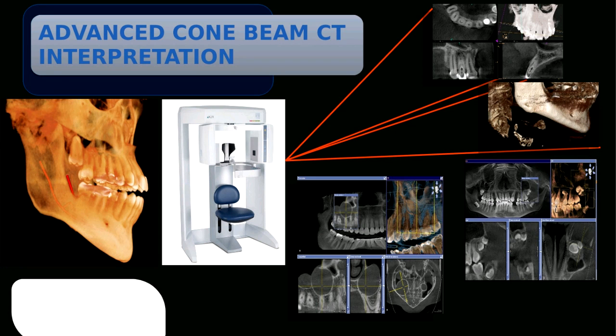We are going to talk about advanced cone beam computed tomography interpretation. This is a very useful lecture. It will be very useful in your career and in your clinical practice. If you're going into residency or private practice, especially for the practitioners, this is a very good lecture for you.